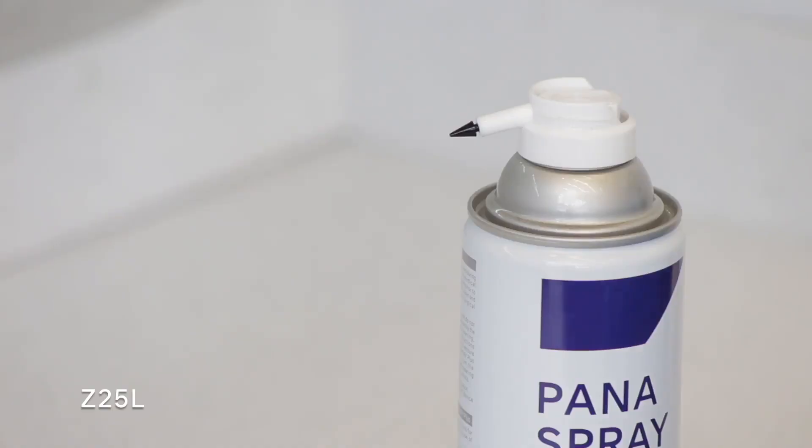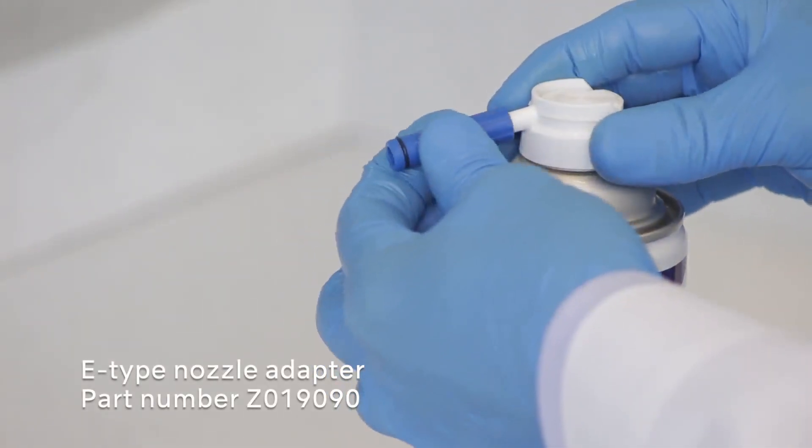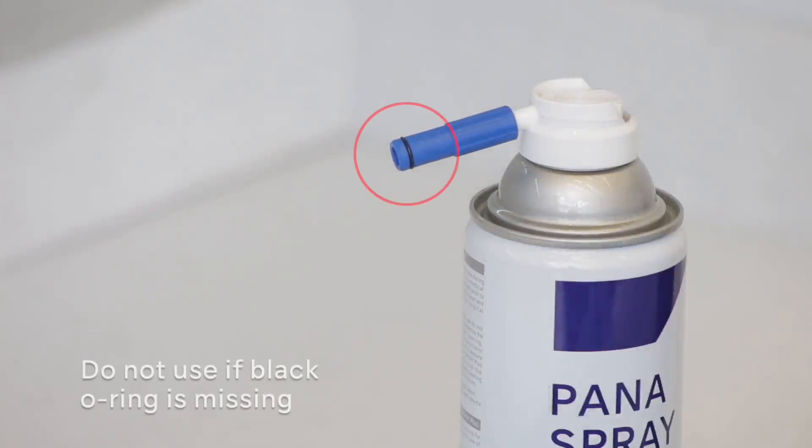Mount the E-type nozzle adapter, part number Z019090. This goes on top of the spear-shaped nozzle and is used to lubricate the back of the attachment for the main lubrication. Make sure this O-ring is not missing. If it's not there, you'll need a new nozzle adapter to make sure the connection is perfectly sealed.